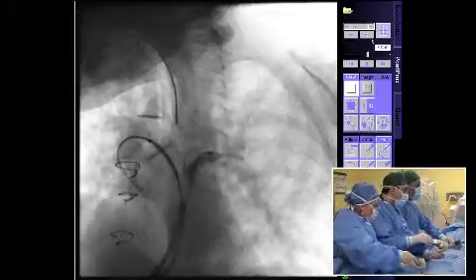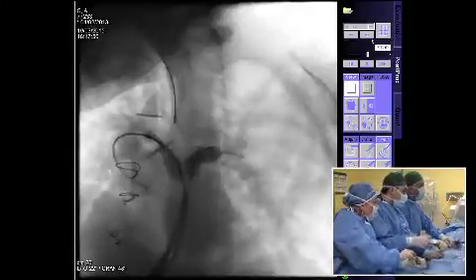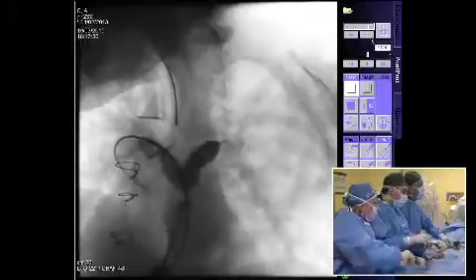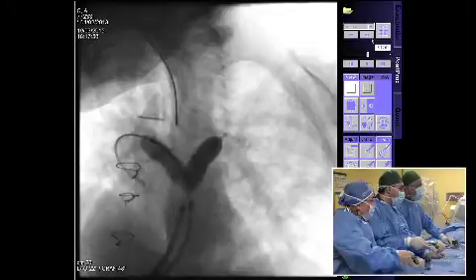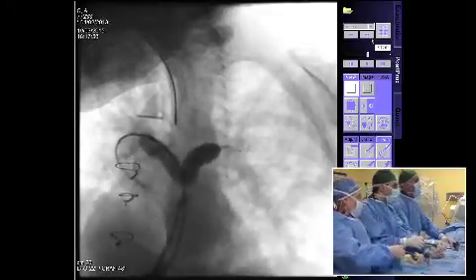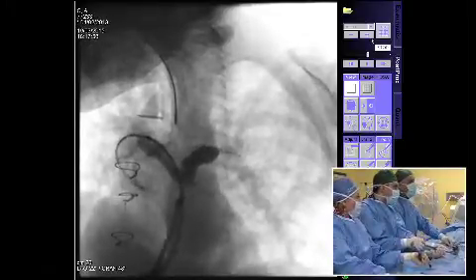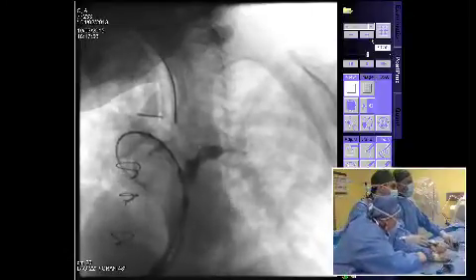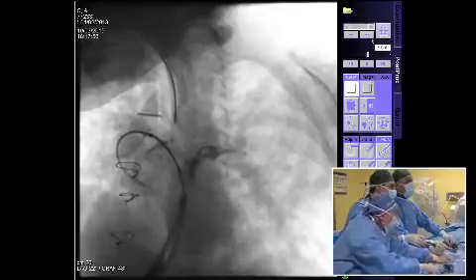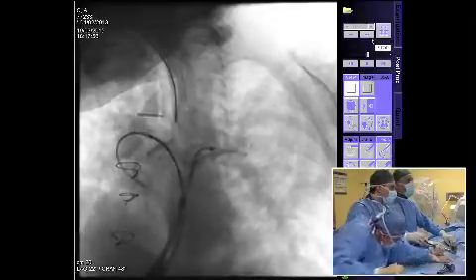Go ahead, go ahead, go ahead. Please deflate. Pressure going down a bit, but now coming back. Okay.